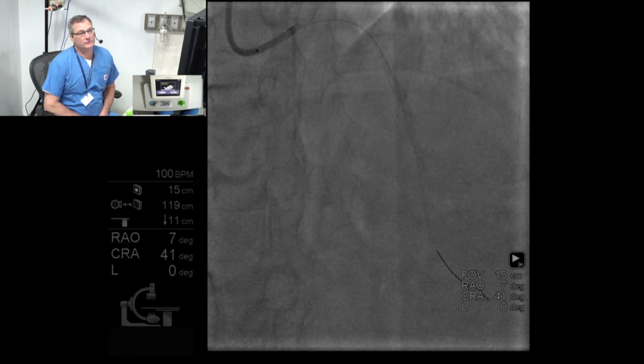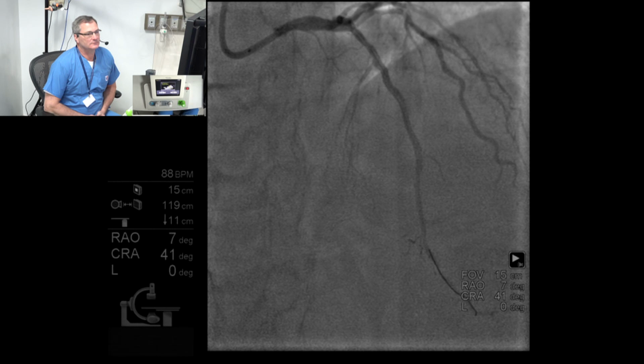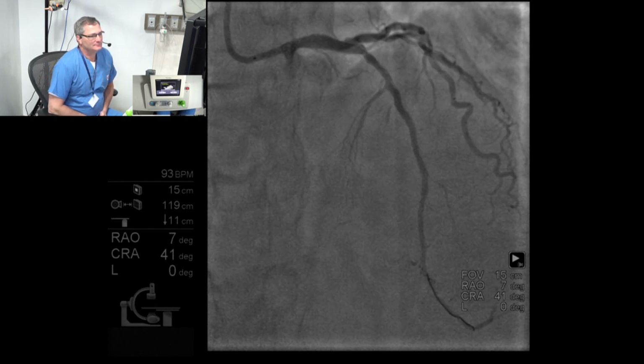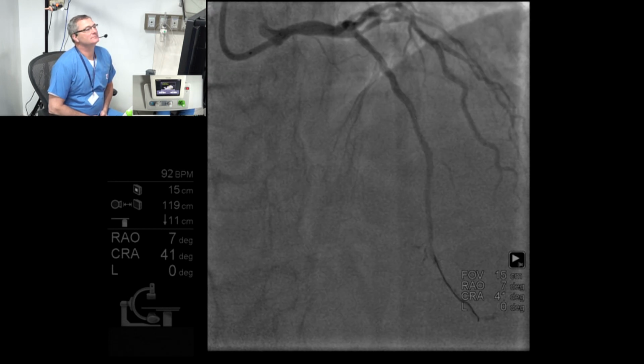Is he doing okay, Tejas? Is he feeling okay? There is some discomfort, it's okay. The stretch pain is much more in the population over here. They complain for sometimes days and many days.